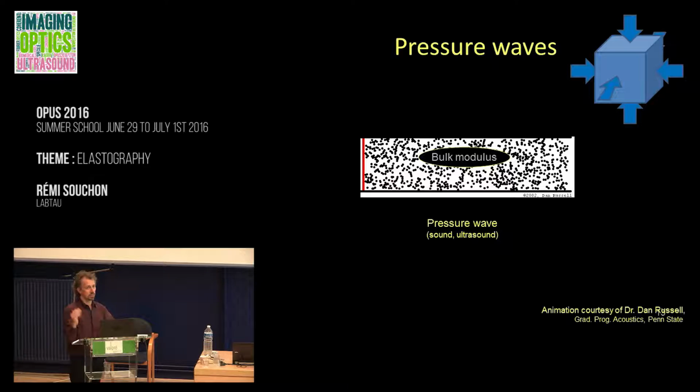And so we see we have two different dynamics. One is particle velocity, and the other is the velocity of sound, because what we're looking at is the sound wave. It's the same in ultrasound, or the same sound wave I'm using now to talk to you. The particular aspect of these pressure waves is that the particle vibration and the propagation of the perturbation are collinear. They're all horizontal in this case, and we speak of longitudinal waves.